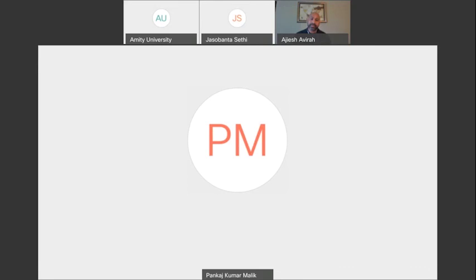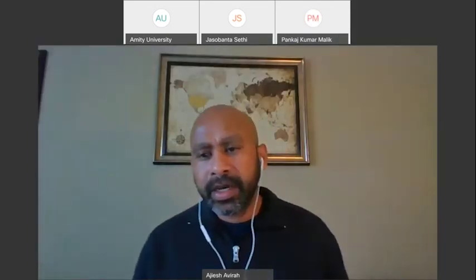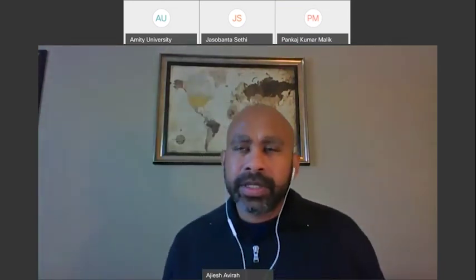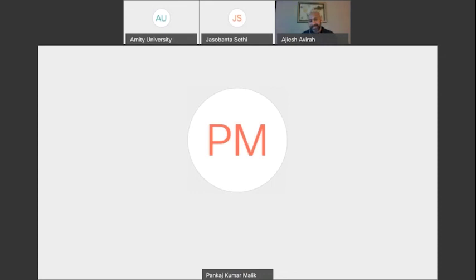I have another question by Dr. Jayaprakash. He has asked if there is any way it can be used in case of a fistula in a dialysis patient. I wouldn't use that. Okay. Again, in a dialysis patient, when you are occluding a large extremity like a limb for so much time, there is a backflow, right? There is increased blood flow. The heart is doing the same kind of job, and the amount of blood in the body is the same as before this application. So there is increased pressure in the other parts of our body, especially in the kidney. We don't want that problem. I hope his queries are solved.